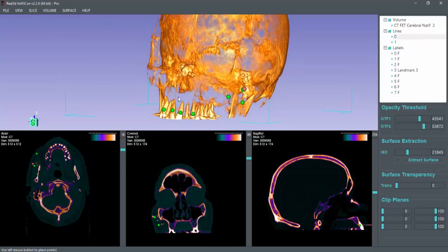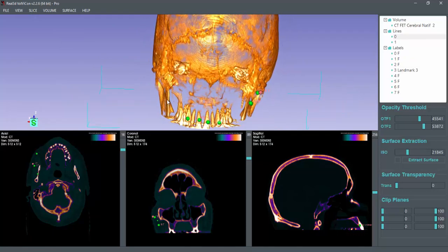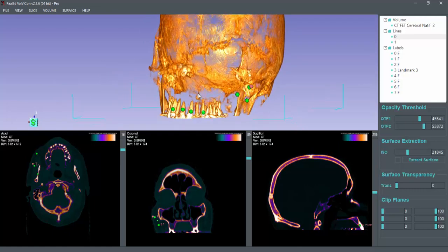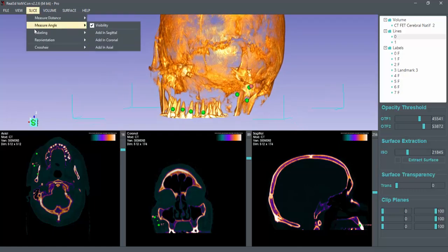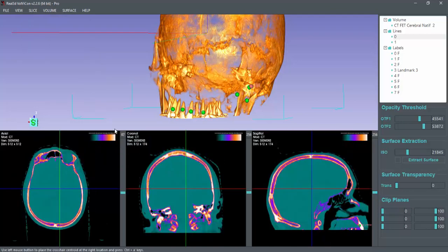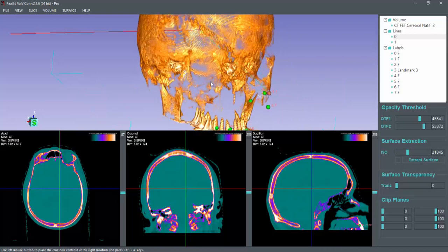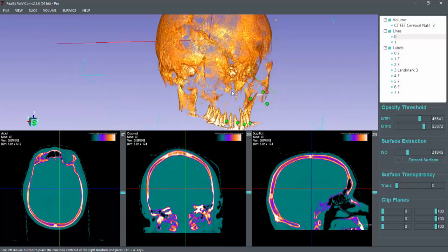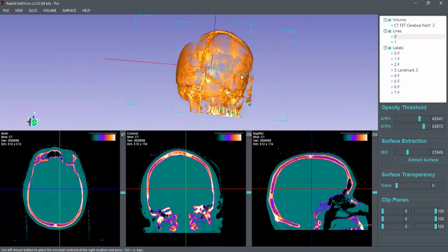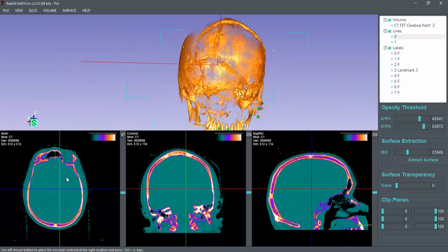For example, if you want to draw a point on a translucent surface, you need to enable the second feature. Start by crosshair, press it, and crosshair will appear onto the model and in the slices view.